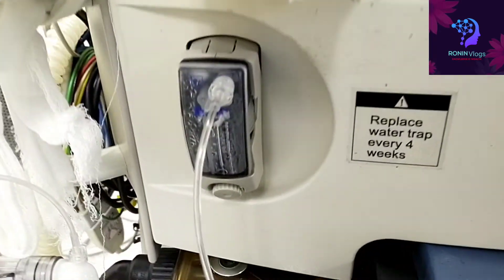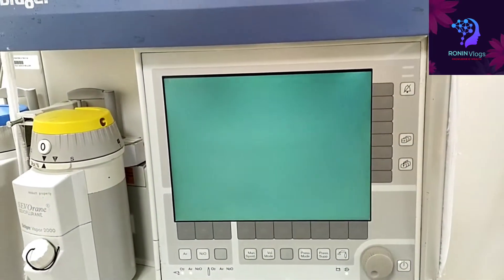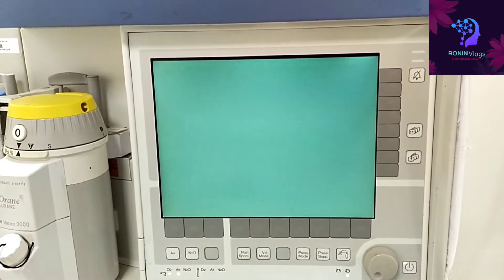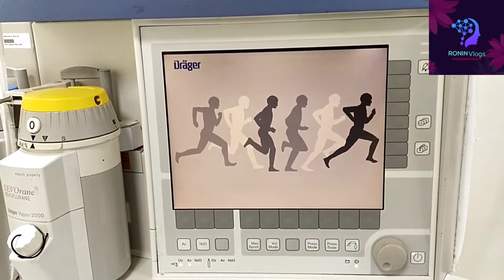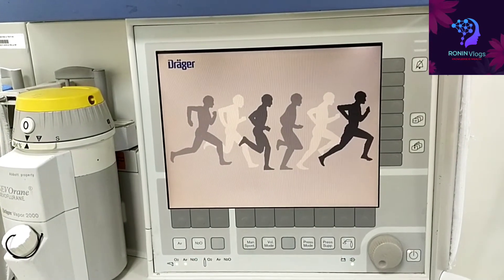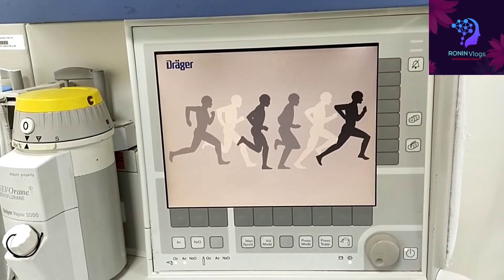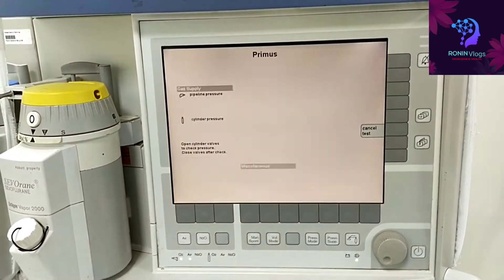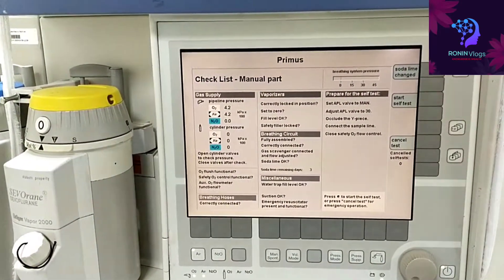This is the water trap — every four weeks, meaning every one month, we need to replace the water trap. The system is now booting, and this self-test process will take a maximum of approximately five minutes.